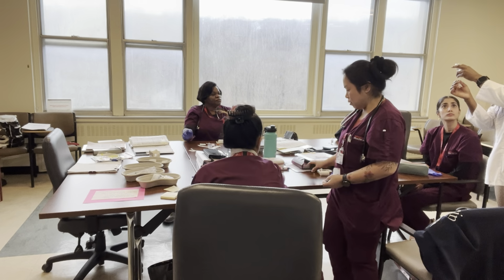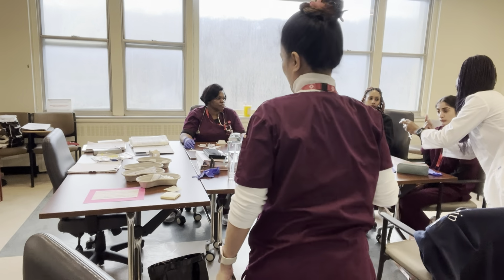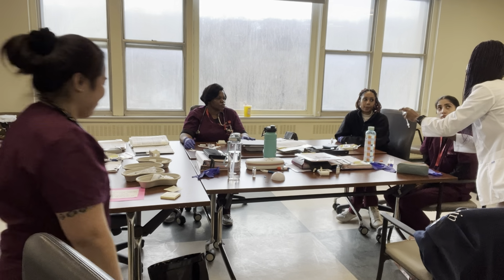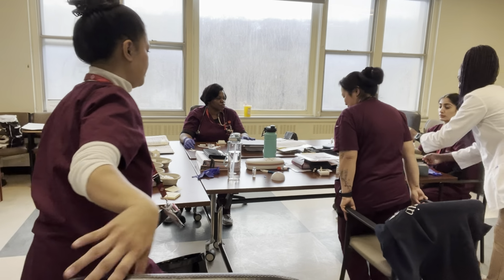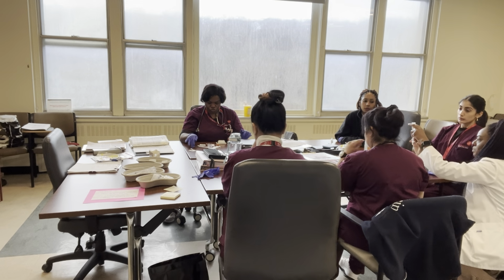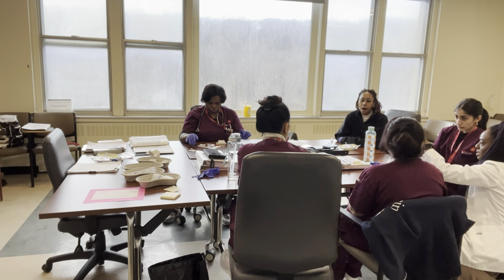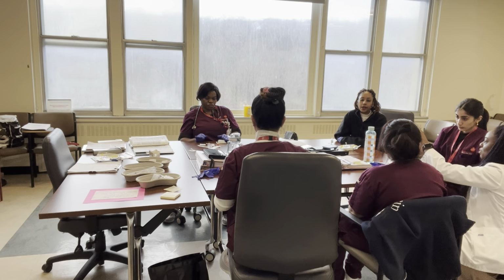So maybe when you're putting it in, see how there's liquid coming out? You're bending the needle too much, and you made the plunger big. I shouldn't feel any liquid, that means you would feel the insulin, it smells really strong. So we're gonna redo the process, because right now there's a drop of insulin coming out. You wanna go a little bit up, so it's directly on the line, and then no liquid coming out.